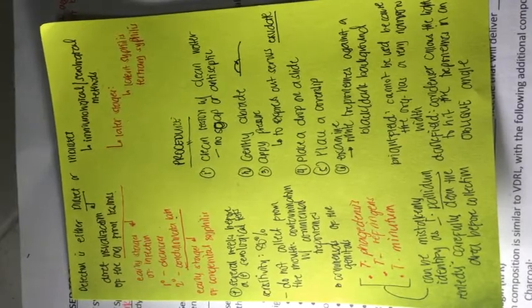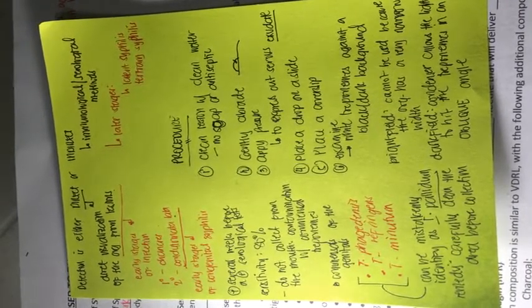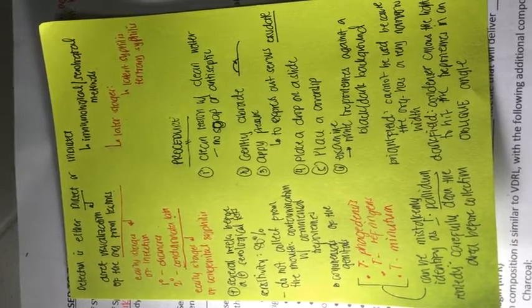So by this, we are done with direct microscopy. Let us now proceed with the serologic tests in the laboratory diagnosis of syphilis.